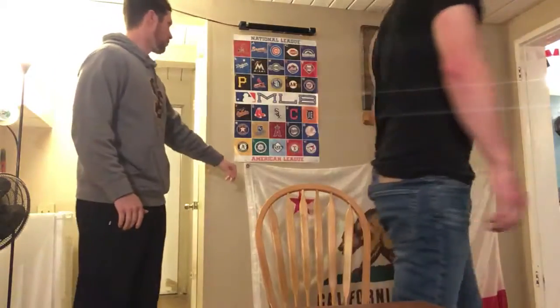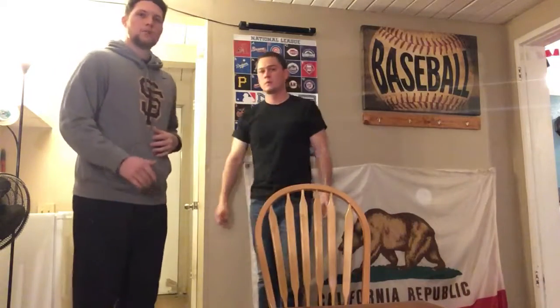Now we're going to do our vision exam. So I'm going to have the patient actually stand up for me. I'll just have you come right back this way. We have our eye chart measured out behind the camera here, 20 feet. We're going to have the patient cover one eye again. We're going to test both eyes in this regard. First, he can choose whatever eye he wants. Cover that eye. I'm having him read the letters off this eye chart here. Go. Okay, you don't have to start all the way at the top with that big E, but you can start maybe midway down, decent sized letters. Read this third line for me.